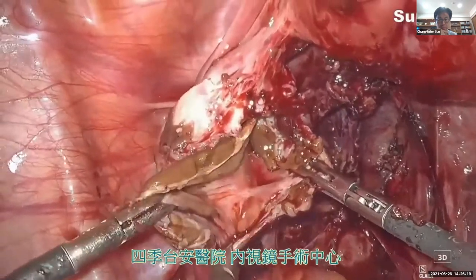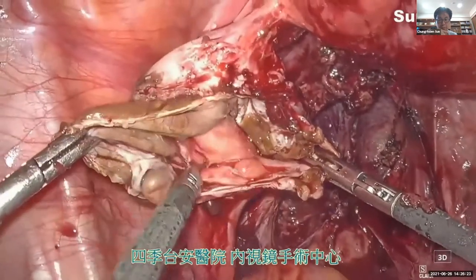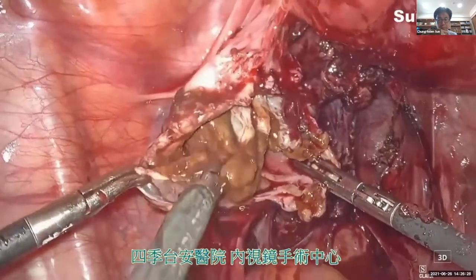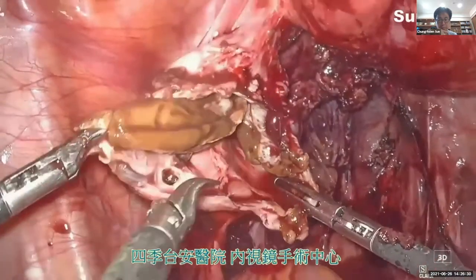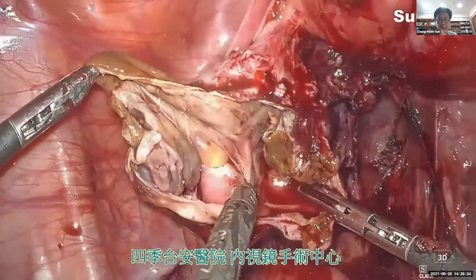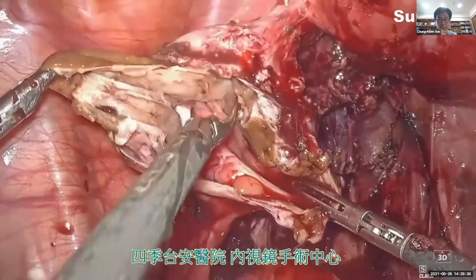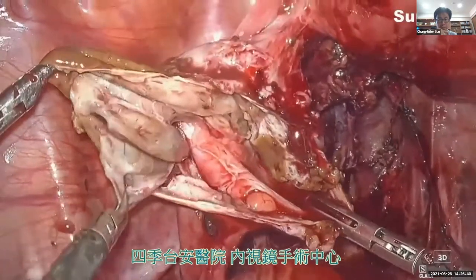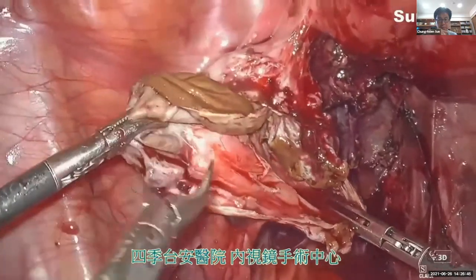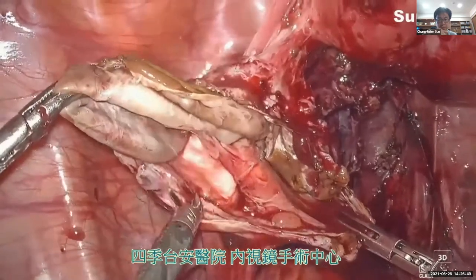We have to perform the cystectomy in a very careful and gentle manner so we can maximally preserve the ovarian reserve. We try to stay as close to the cyst wall as possible. Any tissue attached to the cyst wall should be pushed back to the ovary.